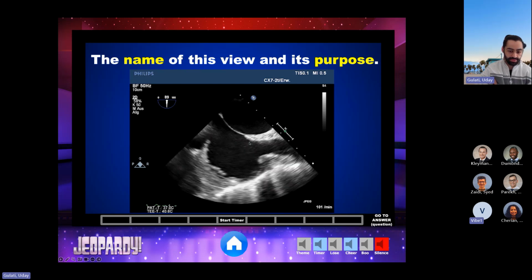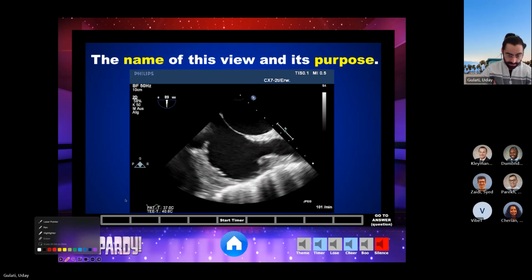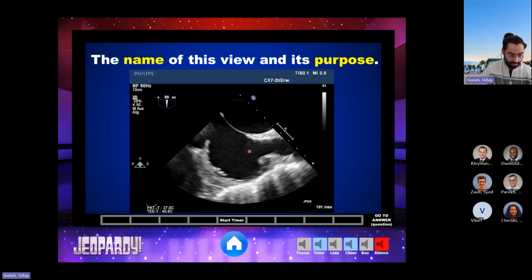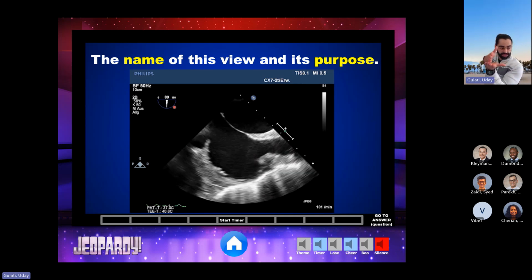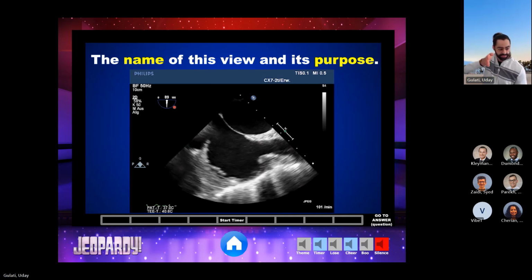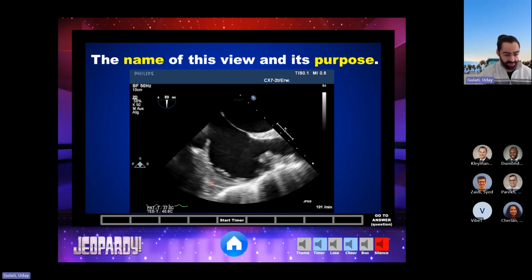Yep, so that's the right atrium. This is your right atrium right here. You guys can see the laser pointer? Yep. And then this is your superior vena cava, and this is your inferior vena cava. And you know that it's tilted because of your probe, you've changed it to 90 degrees. You're normally looking at it like this, and now you change it to this, so that you can match your superior vena cava and inferior vena cava.